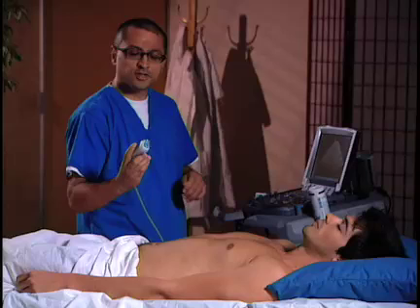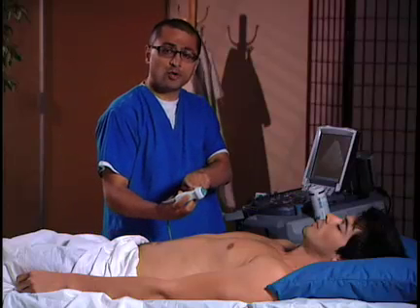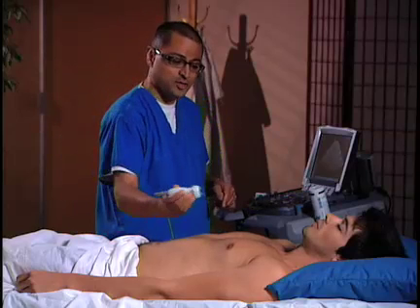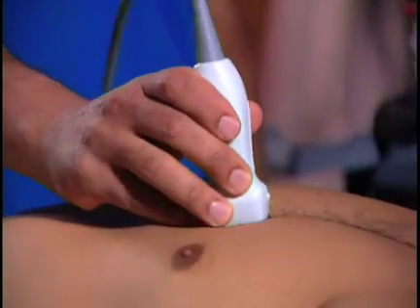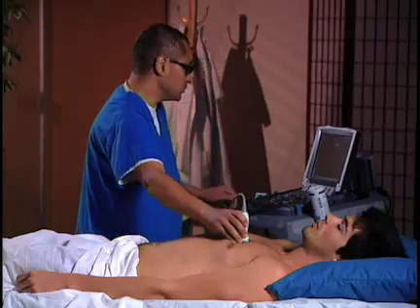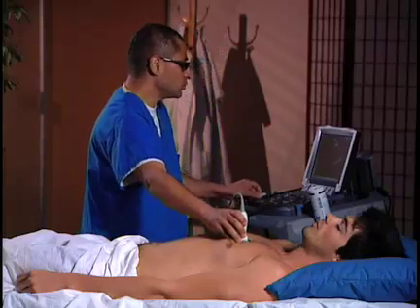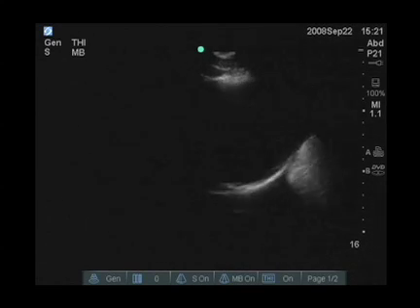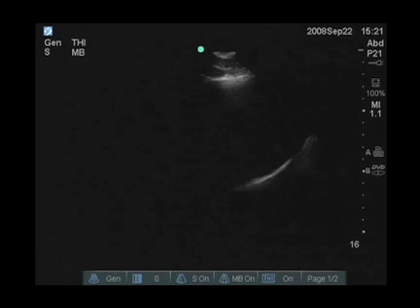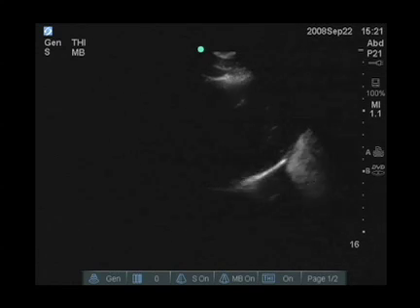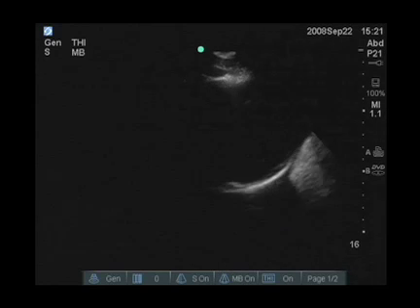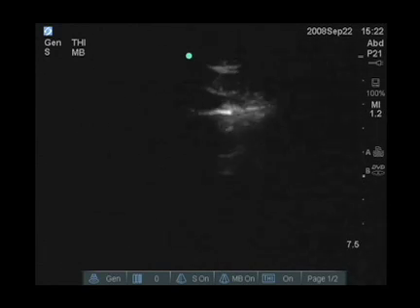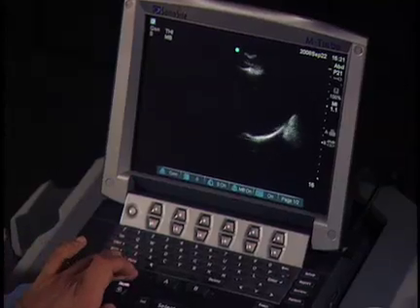We're going to go ahead and start scanning. Here's our probe marker — we're going to aim that toward the patient's head and I'm scanning right now in a sagittal fashion. I'm going to turn my gain up a little bit. We're going to recognize that our depth is too deep. Remember what we're scanning is really superficial — we're looking at the lung surface — so I'm going to decrease our depth so we can see the lung surface quite easily.